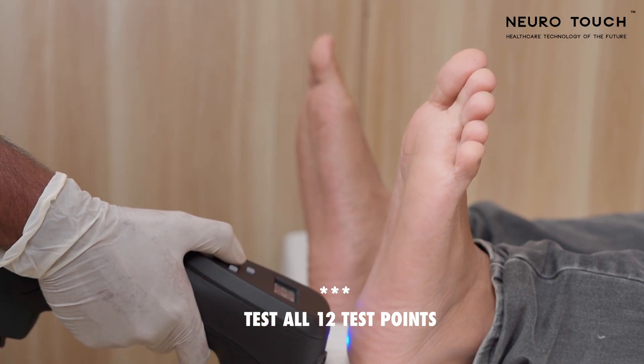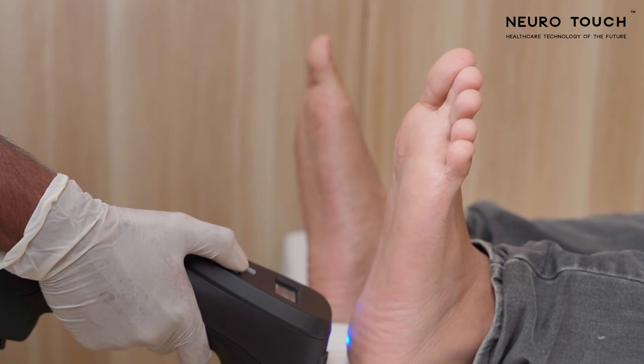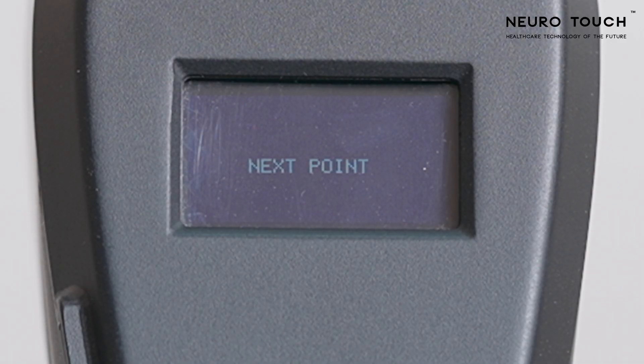Patient response is not needed as we are recording just the temperature. After screening all 12 test points, come back to the home screen by long pressing the left key.